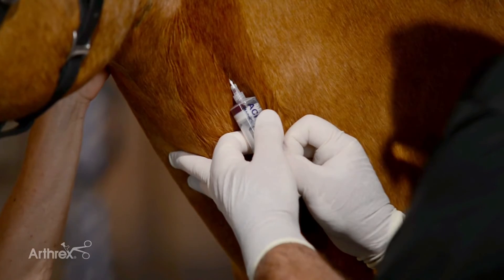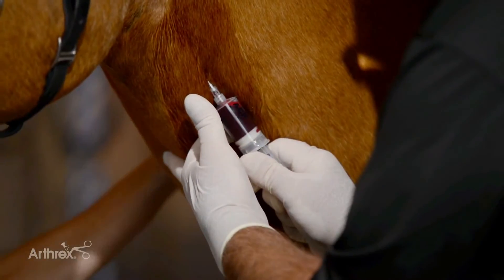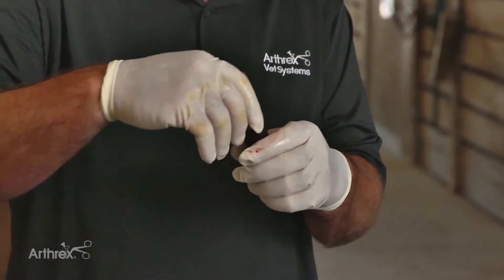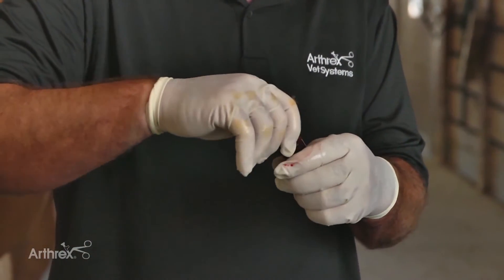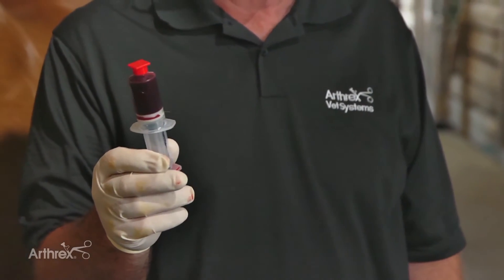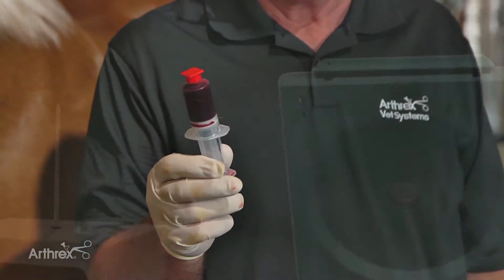We go ahead and harvest the blood up to the 16 ml mark. Then after we harvest that, we put the red cap on and spin it at the appropriate RPMs for five minutes, then harvest the resultant plasma.